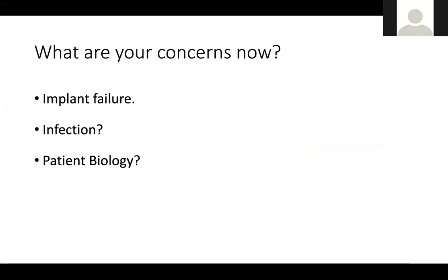That would be fatigue failure. Okay, can you explain fatigue failure to us, please? Quickly. The implant will be undergoing cyclic loading. Since this plate is load bearing, even if the patient is not weight bearing, it suffers from cyclical loading. And depending on the stiffness of the material, it has a limit to how much cyclic loading it can bear before the implant suffers fatigue failure.